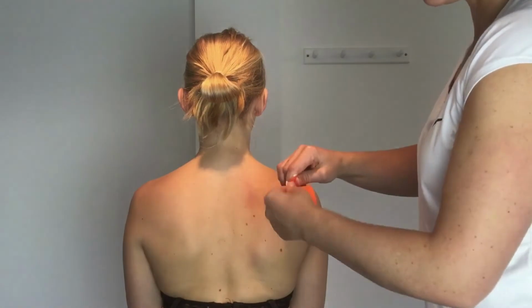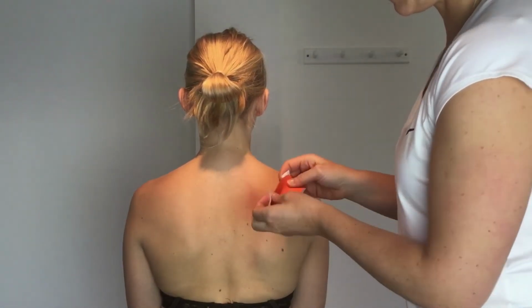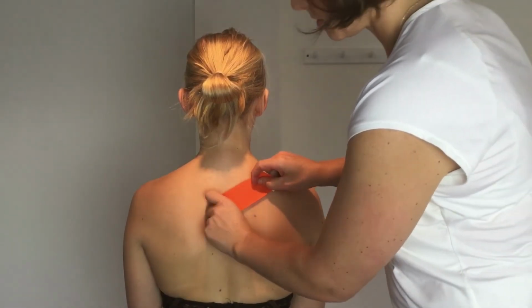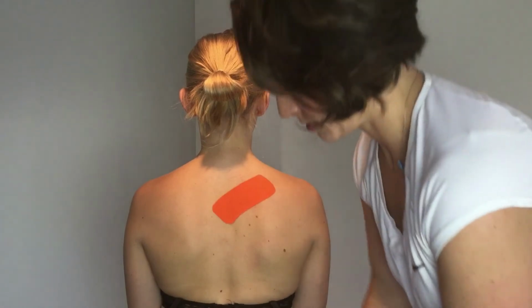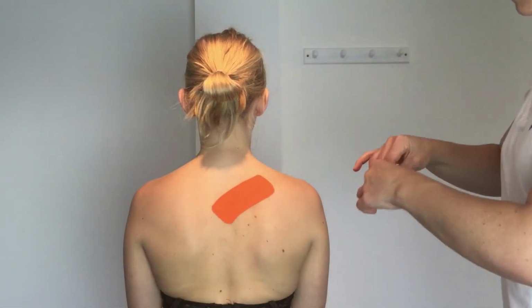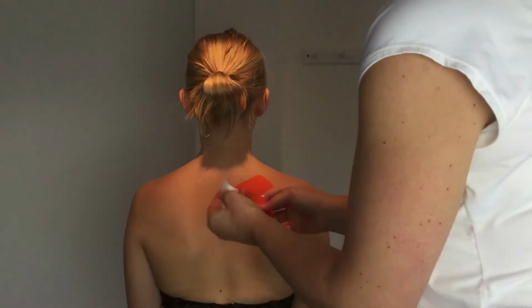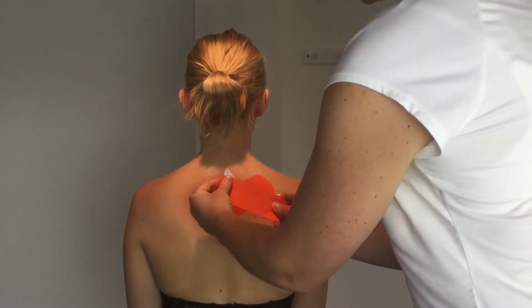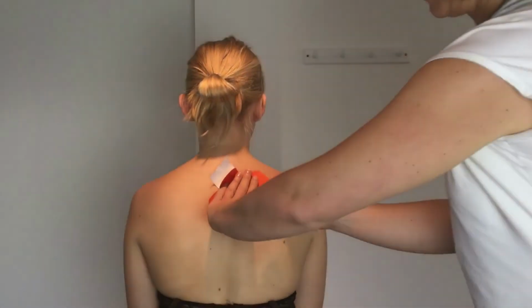A two-step taping here for rhomboid pain or strain. Firstly, to desensitize that pain they have between the shoulder blades. Short piece of tape, we're going to apply the middle first, shoulder forward, light stretch straight down on the area of pain or sensitivity. And we can layer that up. If it's quite painful, quite uncomfortable, you can star that 2 or 3 times. So again, middle of the tape, shoulder forward, light stretch straight down over the area of sensitivity.